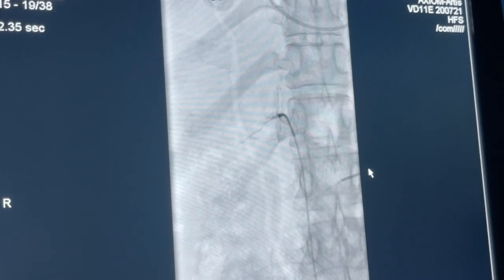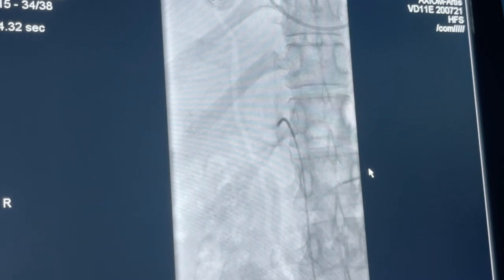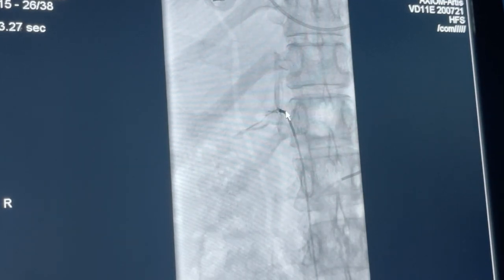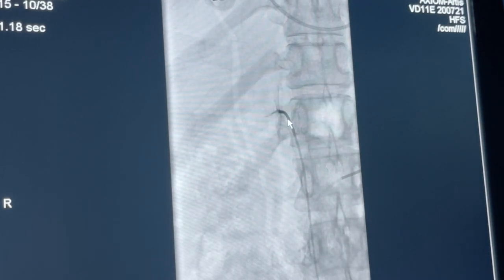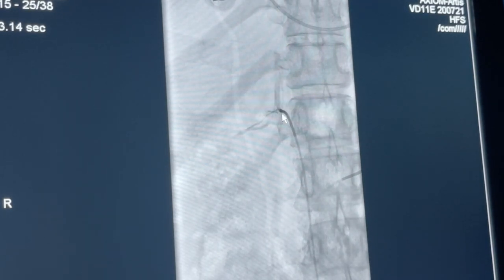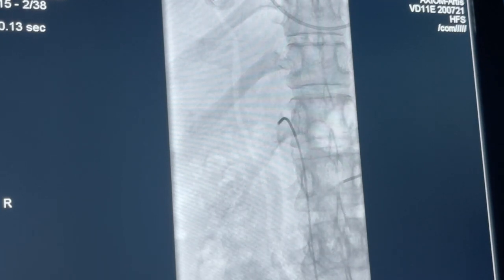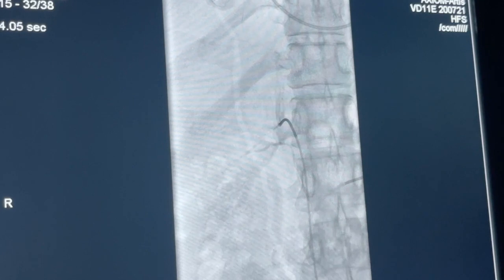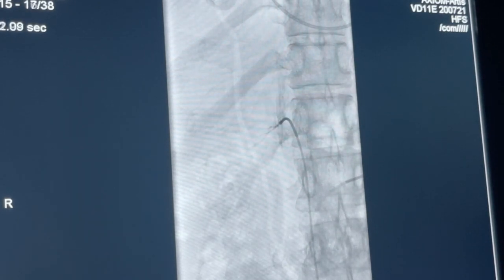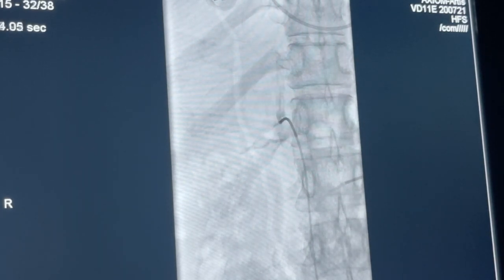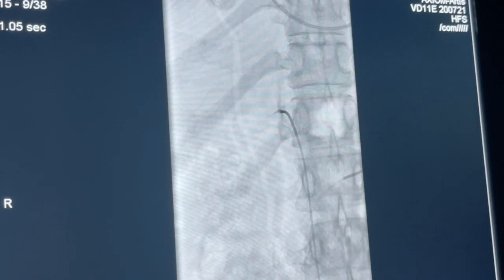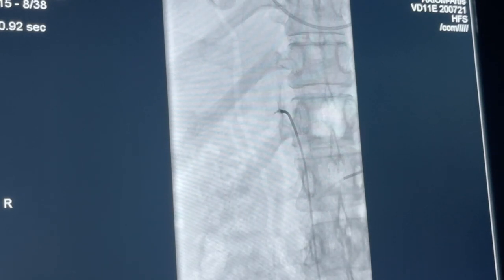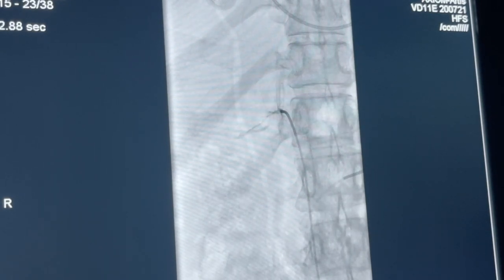Now one catheter is in the left adrenal vein via the left renal vein, and the other catheter enters the right adrenal vein directly from the IVC, bang posterior at the right renal vein level. A sheath aspirate gives the systemic sample. All samples are sent together, and from these results you determine which side is abnormal. Once diagnosed, the surgeon can remove that adrenal gland and cure the patient of a very difficult clinical situation.